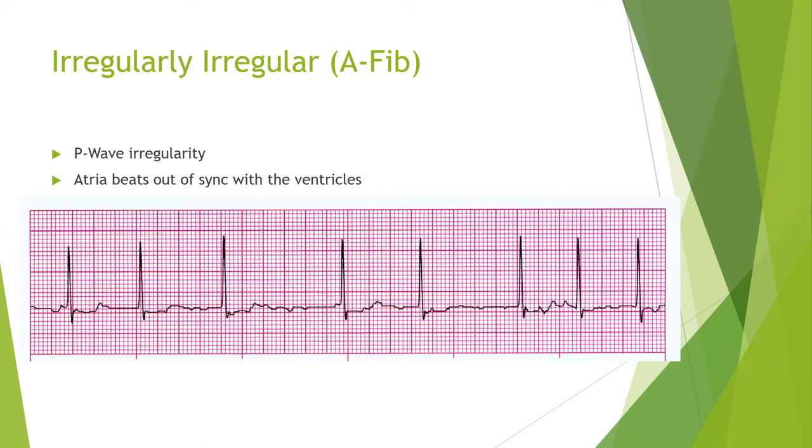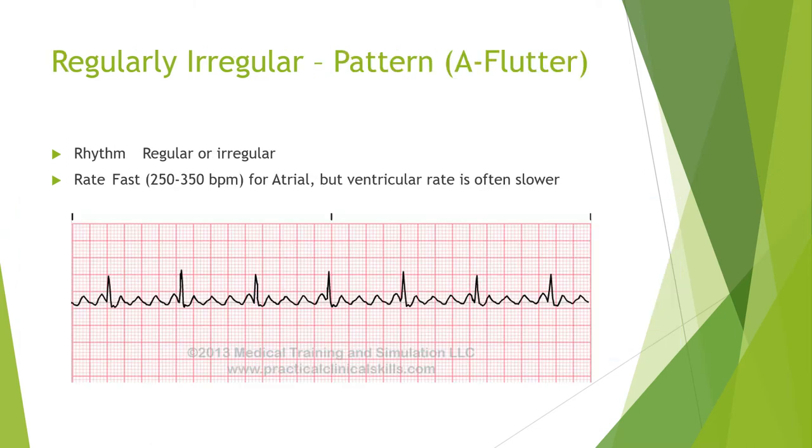Basically, the atria beats out of sync with the ventricles. Your atria may fire, ventricle, atria, ventricle, but it's never really going to be a pattern like that. If you can tell here, this one is really wide, and you got some here that are really close. So there's different patterns. It doesn't line up. You don't see anything that can distinguish this pattern.